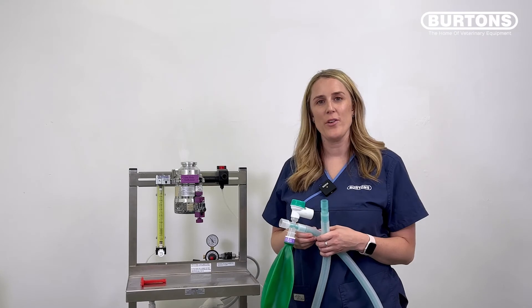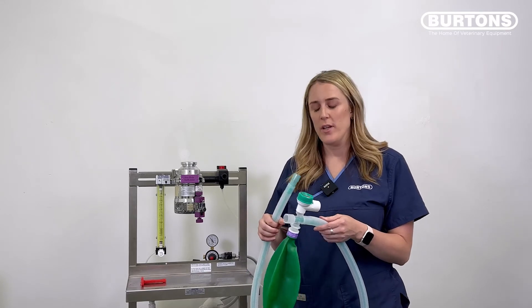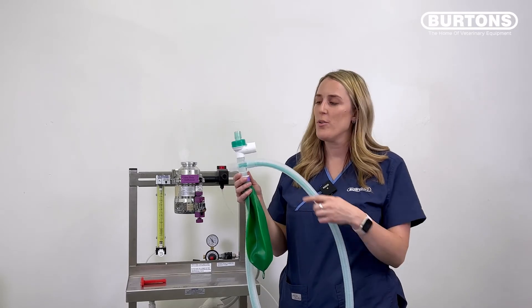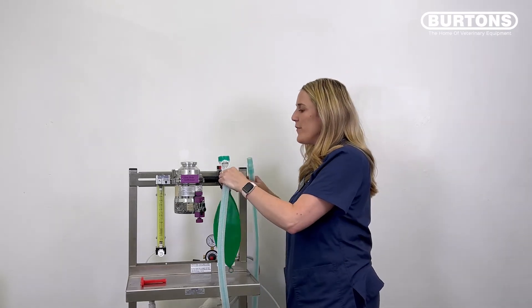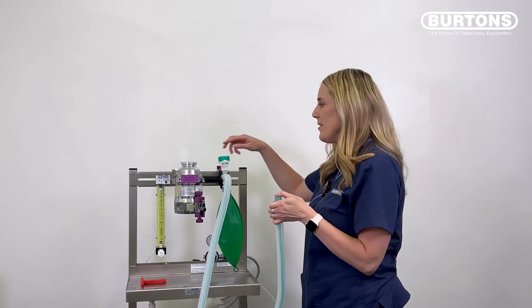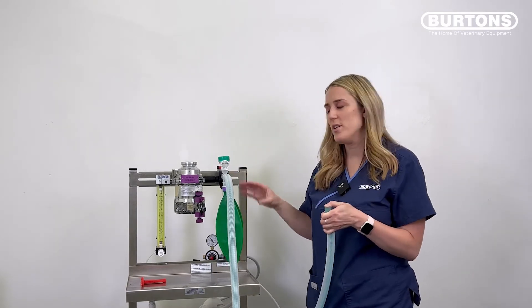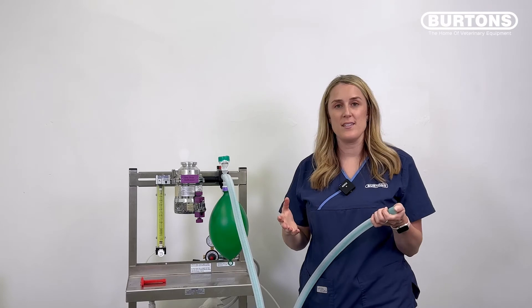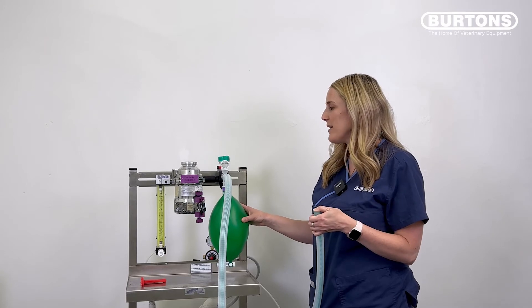In this video I'll be showing you how to leak test a Bain breathing system. The Bain is coaxial — a tube within a tube. The inspiratory tube on the inside is green and the expiratory tube going to the scavenge is white. Introduce the Bain onto the common gas outlet. For the first test — the expiratory limb — occlude the patient end, close the APL valve, and introduce oxygen flow. The bag will fill up and stay nice and taut if there are no leaks. You can introduce some pressure and hear no gas escaping and the bag stays full.